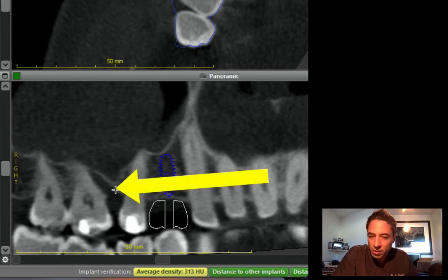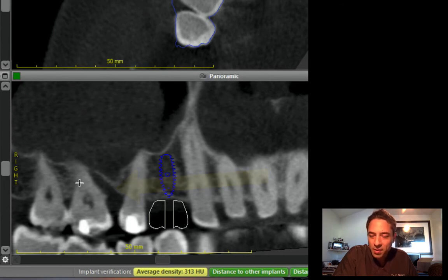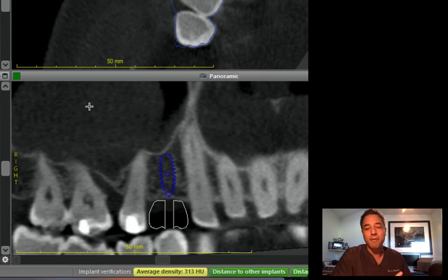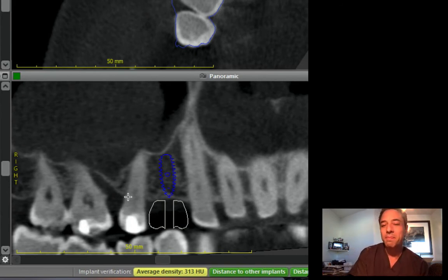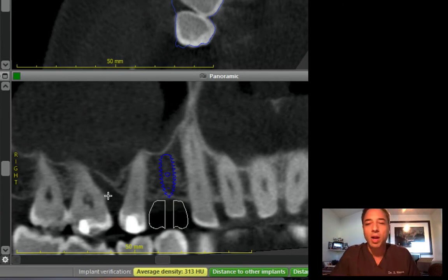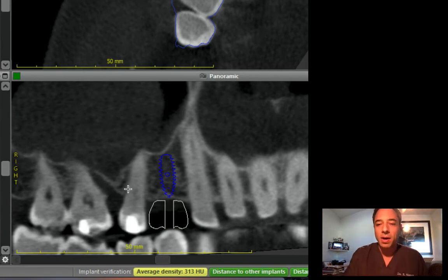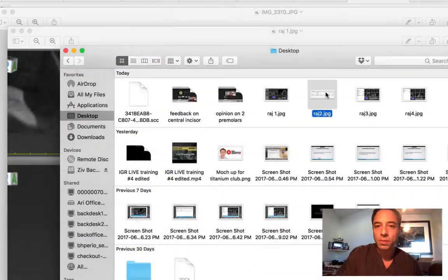So there is a vertical defect right in here, and there's probably an infection communicating with the sinus. So you need to be careful in regards to implant positioning. You may want to address this pathology before you move forward with the implant.